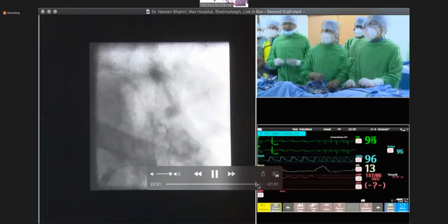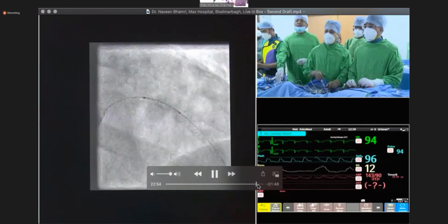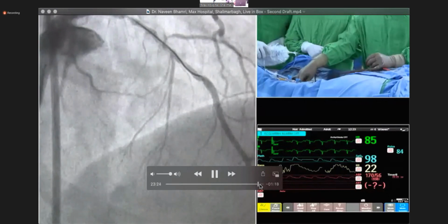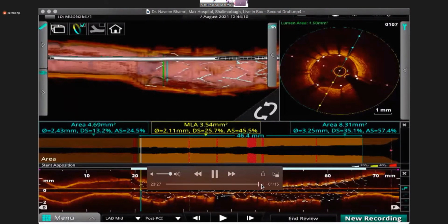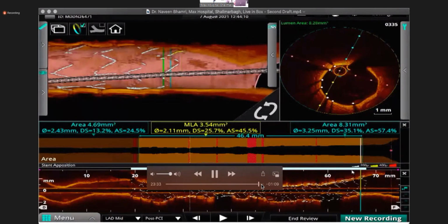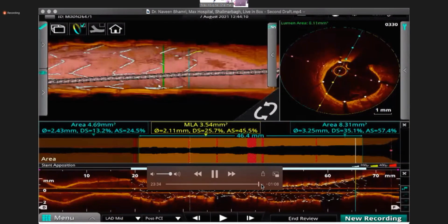We are quite inside, I think. Go up. 15. 16. 18. We have done with the final OCT image and we are okay, because in the stent there is no malapposition seen, there is no distal and proximal edge dissection. We are very happy with the OCT image now, and we'll take a final shoot and we'll come out.